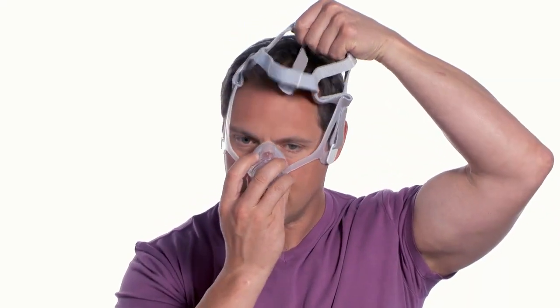Pull the mask over your head, placing the mask cushion in position over your nose. Press the headgear clips into place to reattach, or thread the tabs through the slots in the frame.